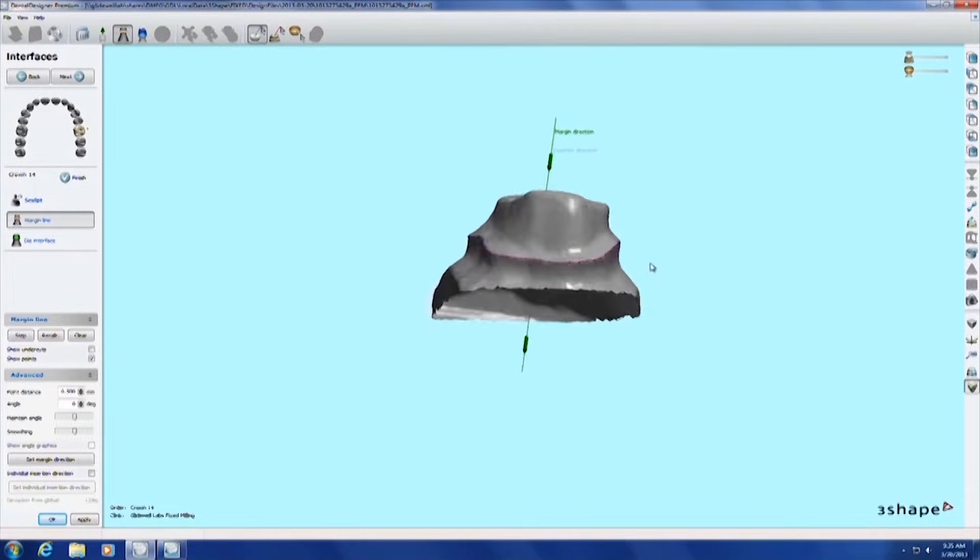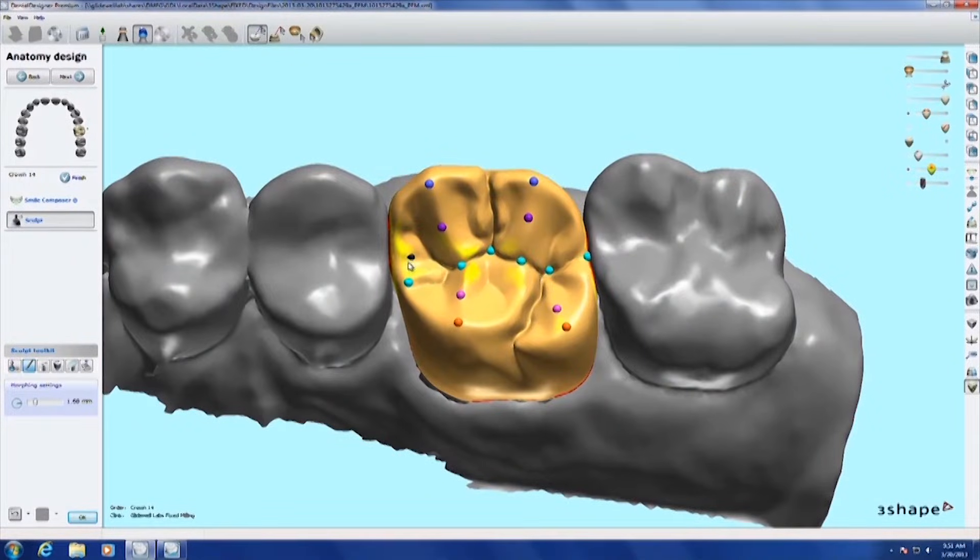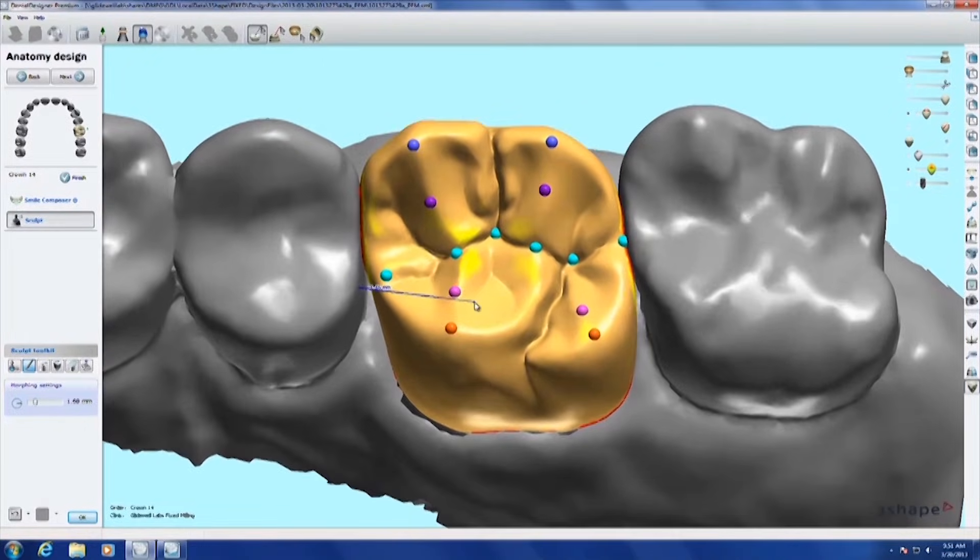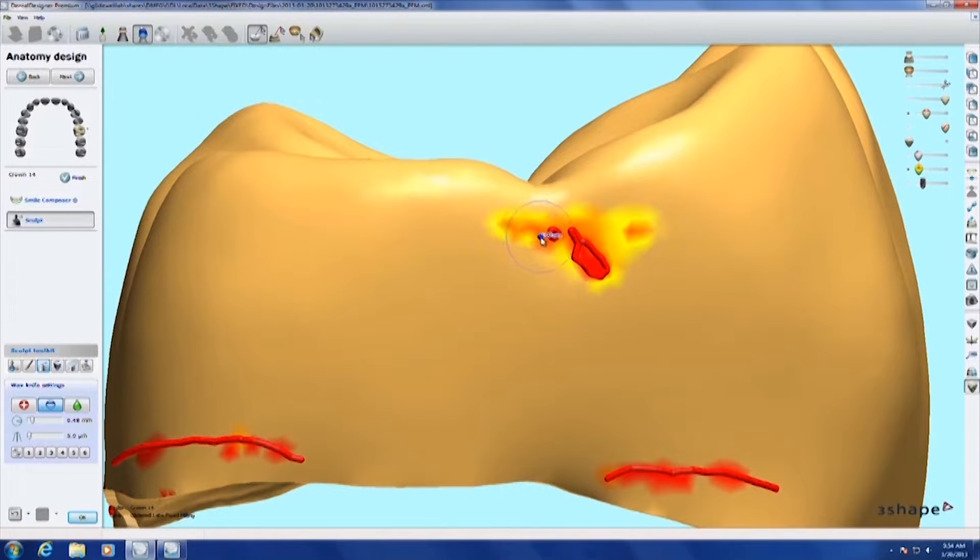We're going to mark the margin here and move it around and try to be true to it. As long as the dentist has left us enough room, which this dentist really did, you can see we've got an ideal anatomical pattern that it's going to propose for that particular crown.